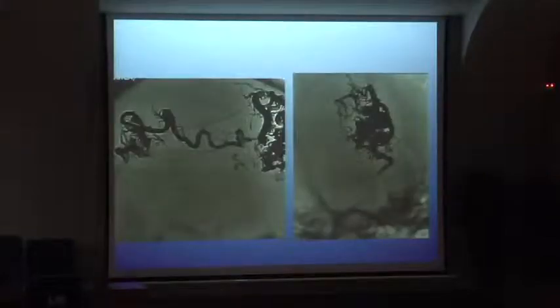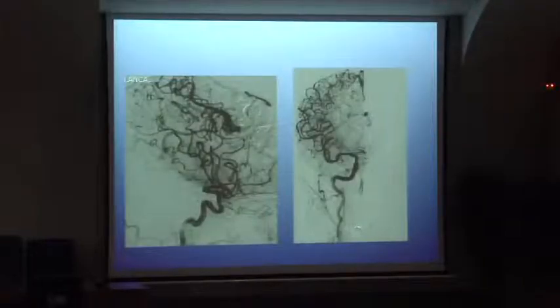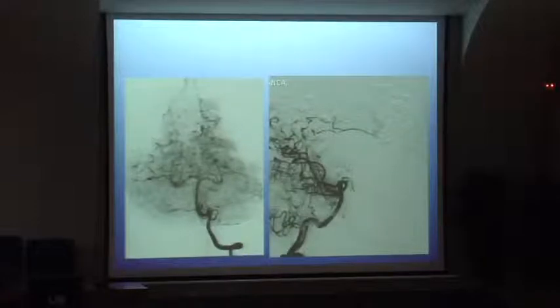It's impossible to know, it's not possible to go to the nidus. No, it's not true. See, it is going. Next. Look at this, subtotal occlusion of the AVM only with the collateral circulation. Next. This is the final control after this embolization.